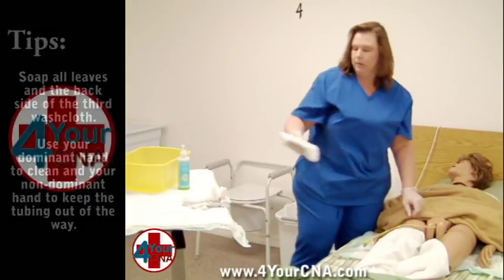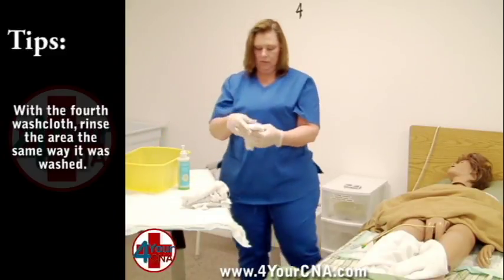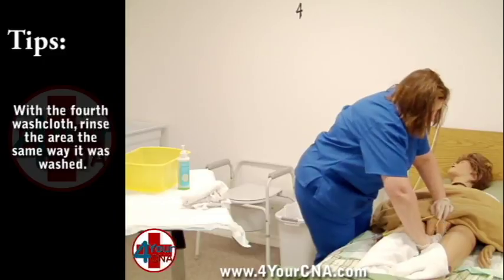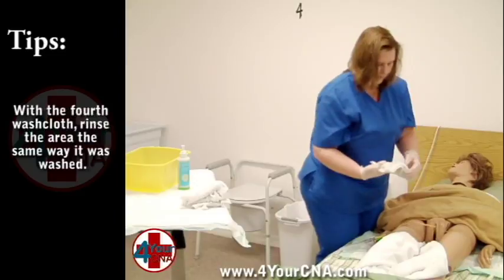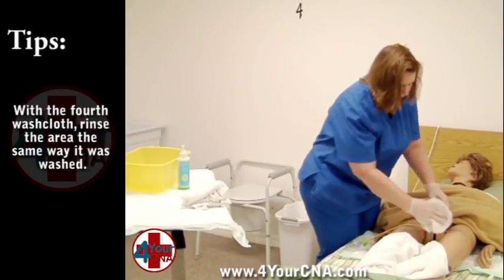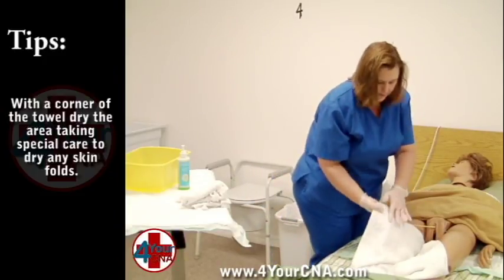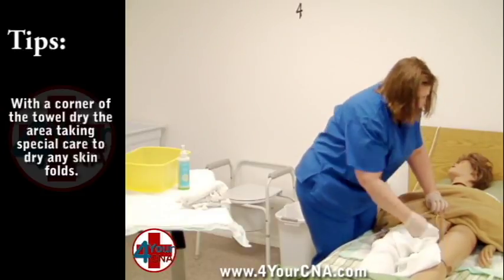The washcloth is discarded to the side. Bring out the last washcloth and rinse the area exactly as it was washed: once down the middle, fold; one side, fold the corner; the other side, fold the corner; skin fold, fold the corner; and the last skin fold. Using a corner of the towel over the patient's thighs, dry the perineal area from top to bottom, making sure the skin folds between the leg and the groin are thoroughly dry.